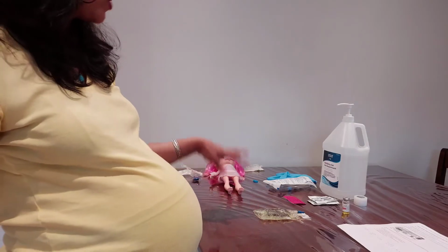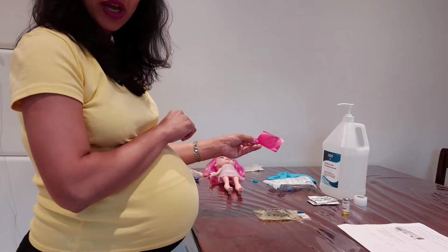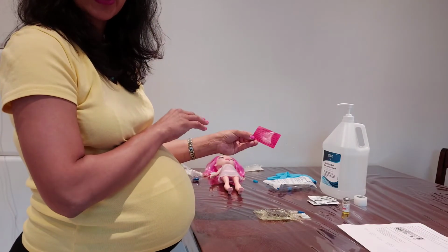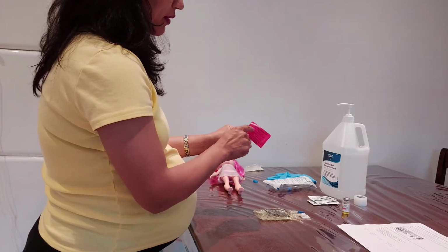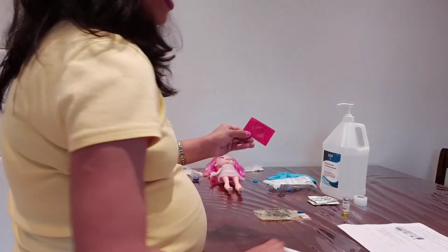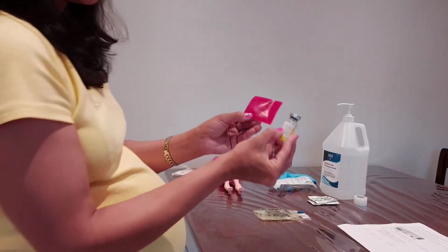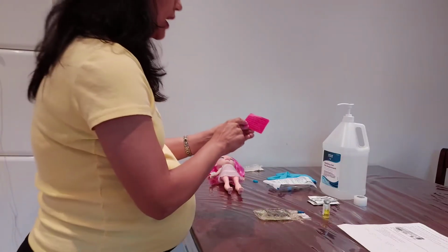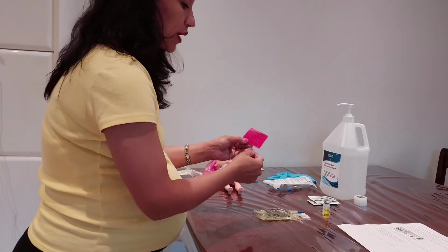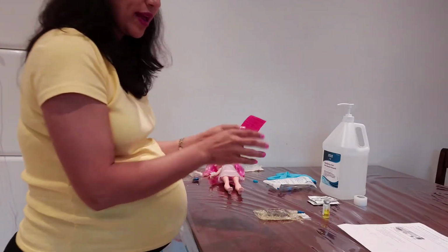Everything is okay now. Now I have to check again and do the second check of the name of the medication and dose against the MAR. The name is for the patient. The drug is pantoprazole that I added. It's pantoprazole 40 milligrams, and it's according to the MAR. Today everything is okay. I will do the second check and make sure that everything is okay.